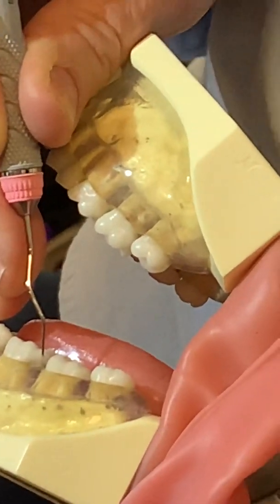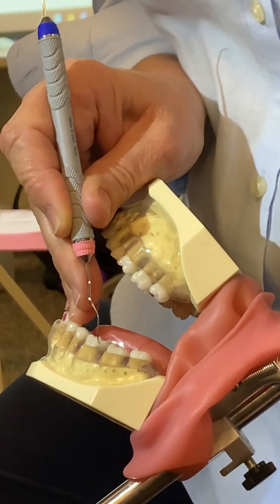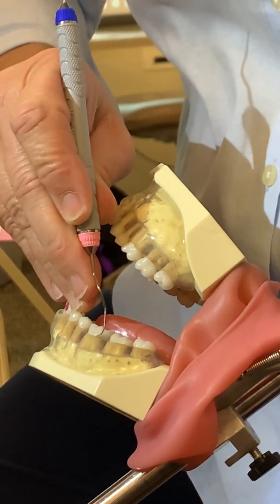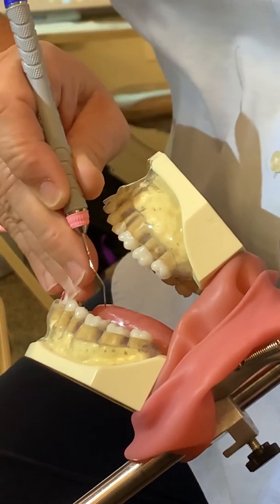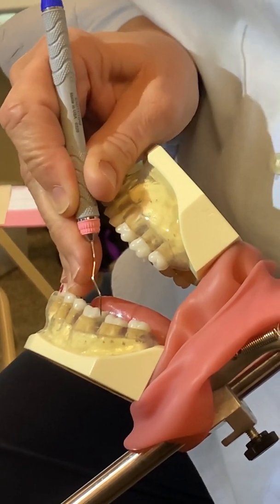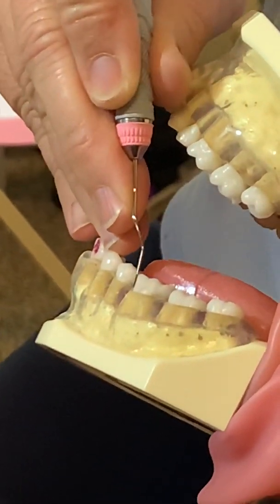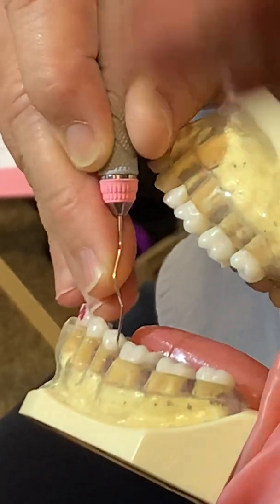Okay, notice where my arm is right now, right against my body, okay? Lift it out, and then start your roll and lift your elbow just a bit. What just happened? See, I didn't have to do the whole roll with my fingers. And it's not like way out here. It's just help yourself out. Go into the distal, lift your elbow just a bit, and it gets you ready. And the mesials are going to feel crowded here. You're going to feel too near your fulcrum a little bit. But it kind of has to happen.